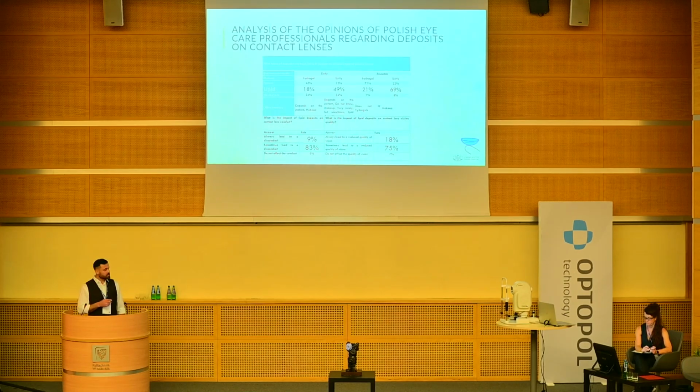At the last slide on this part, I just want to show you that this is the problem which is noticeable by the eye care practitioners. This is the study that we conducted in Poland, and the ECPs told us that they can see the lipids on the lens surfaces, and they know that there is some kind of connection between lipids and the problem with comfort and problem with vision.